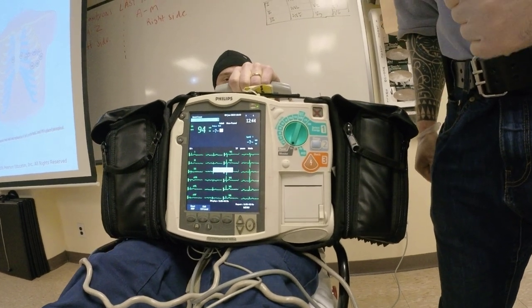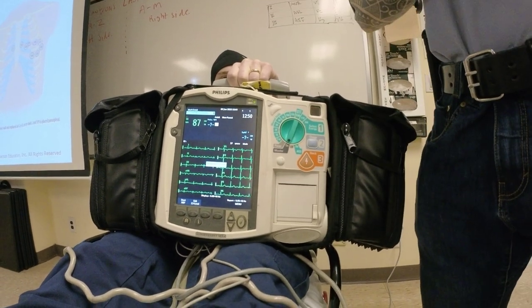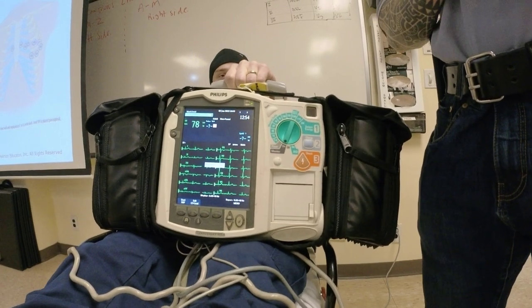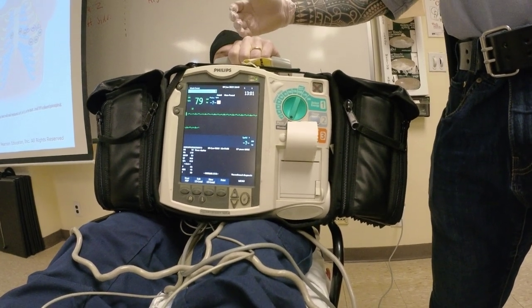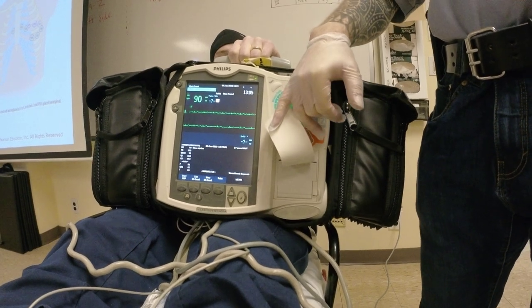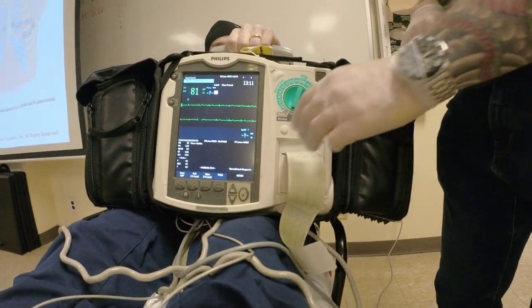By the way, if a patient was having chest pain or you believe there was ACS, the moment I get a 12 lead, should I just take everything off? What should I do? For how long? All the way to the hospital. You want to get serial 12 leads. You want to get one at first contact, one during transport, and one right before you roll them in, because he may not have ST segment elevations. The moment you roll through the door, all of a sudden your EKG changed. Dynamic EKG, right?